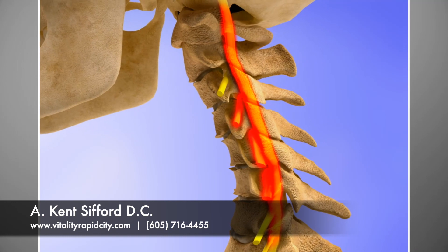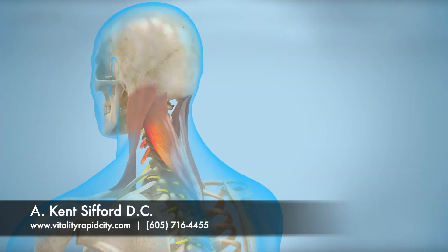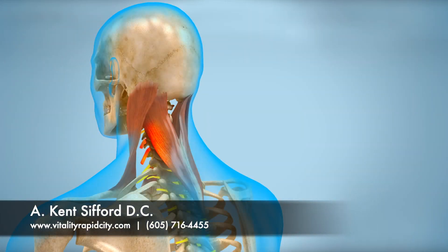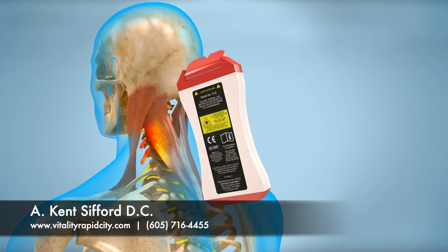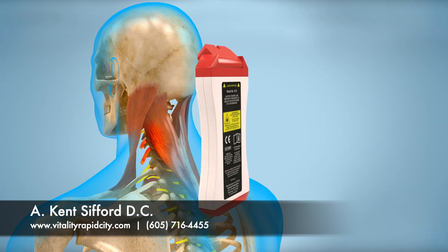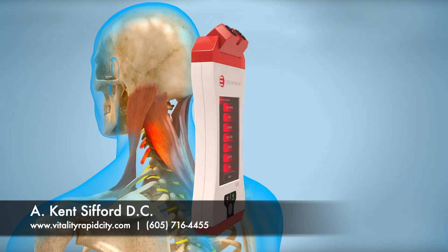A safe and effective option for those suffering from chronic neck and shoulder pain is incorporating the use of Erchonia low-level laser therapy.